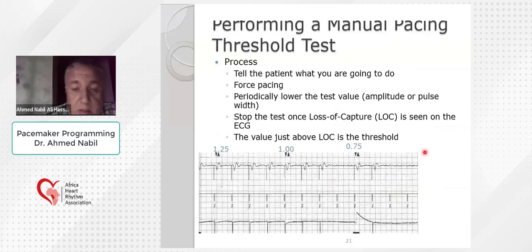This is another example of how to measure the pacing threshold. Of course, when I test the pacing threshold, first I should tell the patient what I am going to do, because he can feel some palpitation.